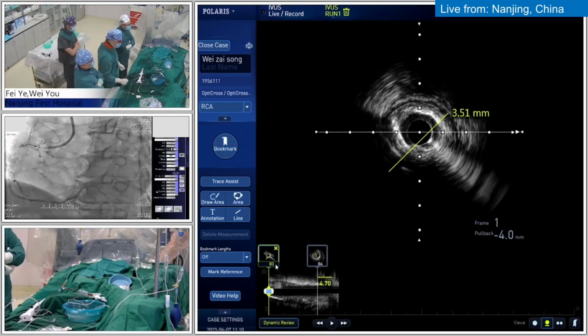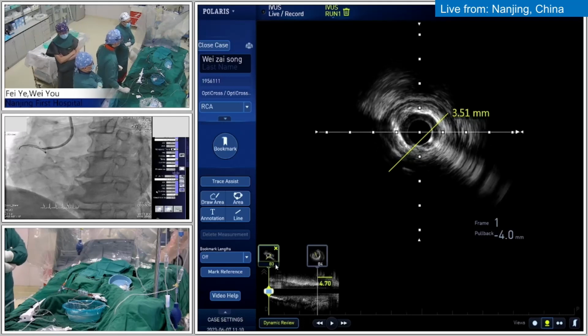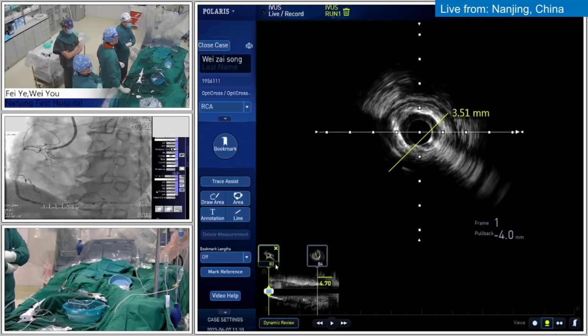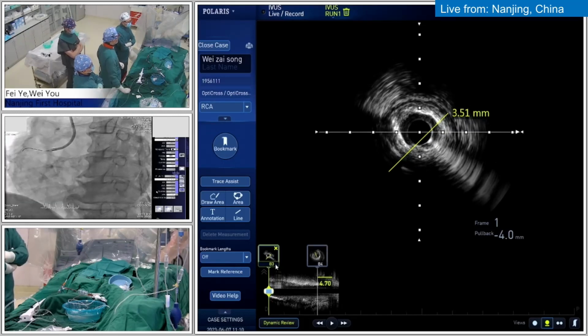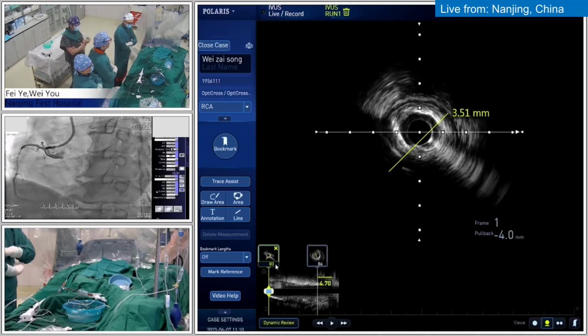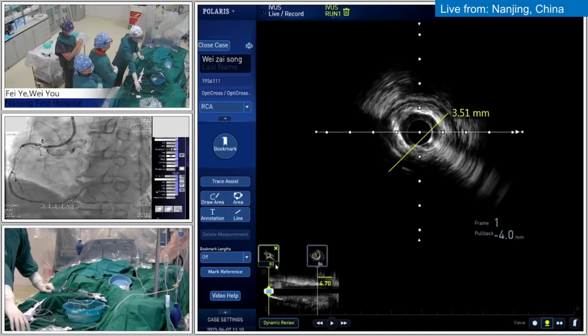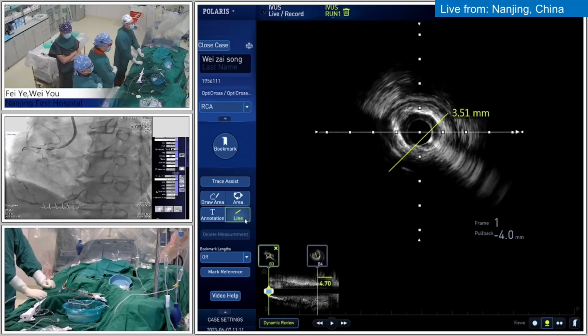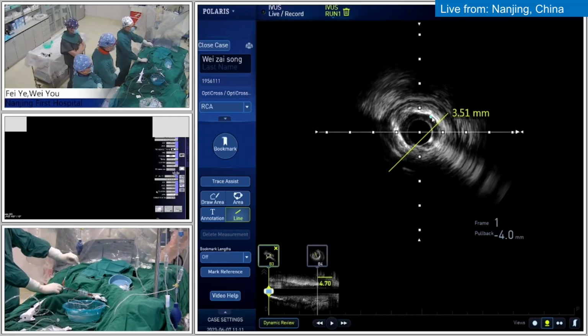Based on the IVUS and angio result, even though you cannot push the IVUS catheter distally, why do you choose the rota first, or why can you not use a small balloon to predilate? Some experts like to use a 2.0 balloon to predilate with mid or low pressure. If the balloon is found to fully expand, we can check the IVUS again to decide on rota or not.